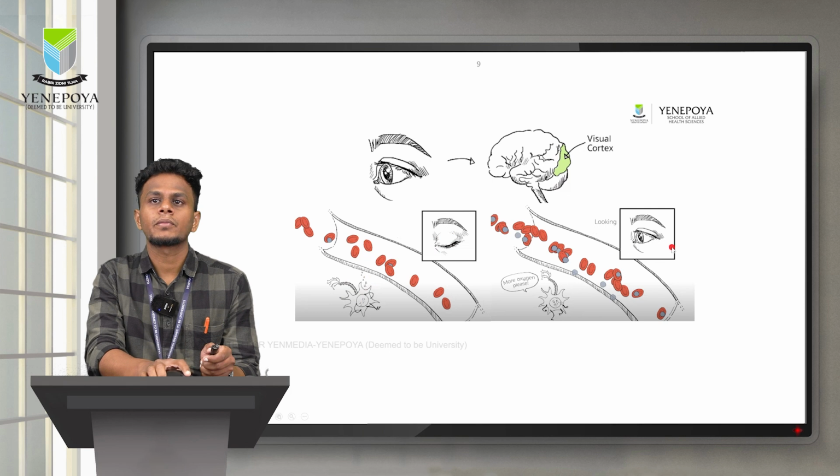But immediately if I give some task to the patient and the patient looks at something, what is going to happen? This neuron is going to get active. It is going to demand oxygen. When it demands oxygen, what is going to happen? The oxygenated hemoglobin flowing through the blood vessel will be taken up by these neurons, because they are going to be under activity.